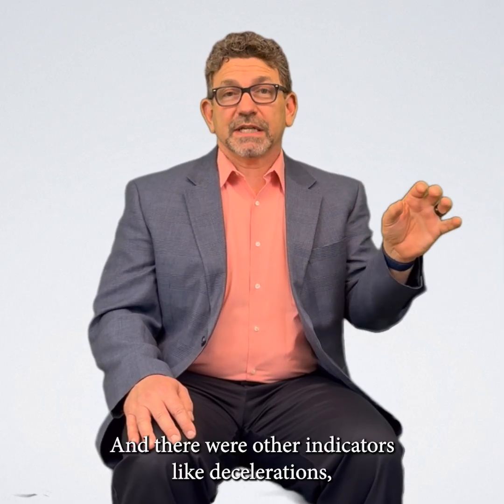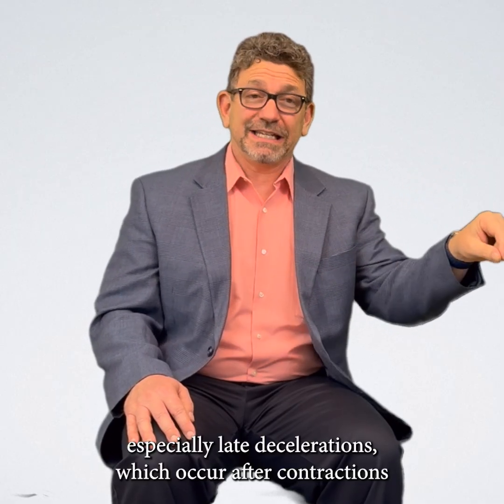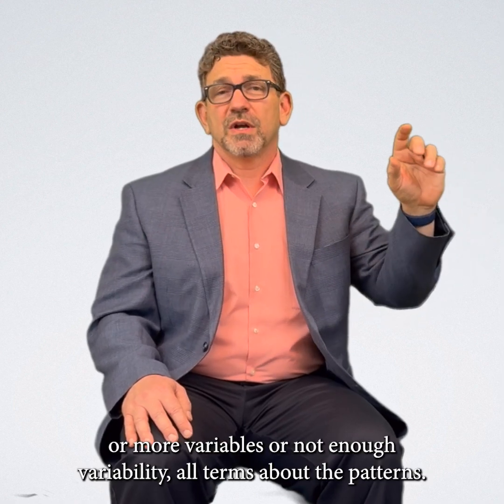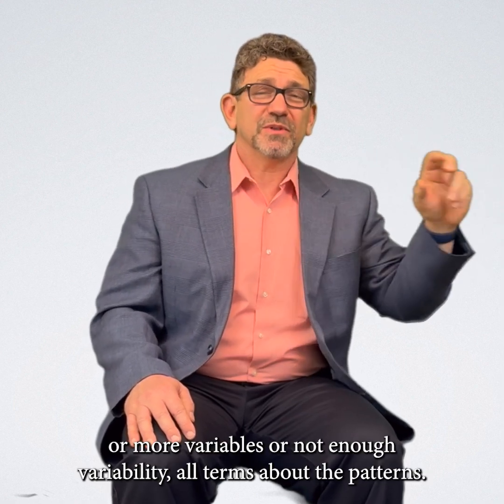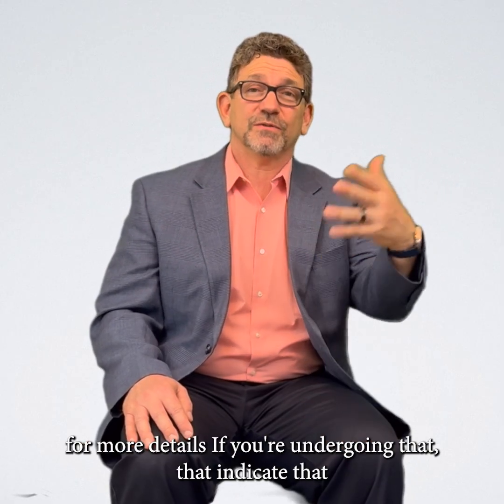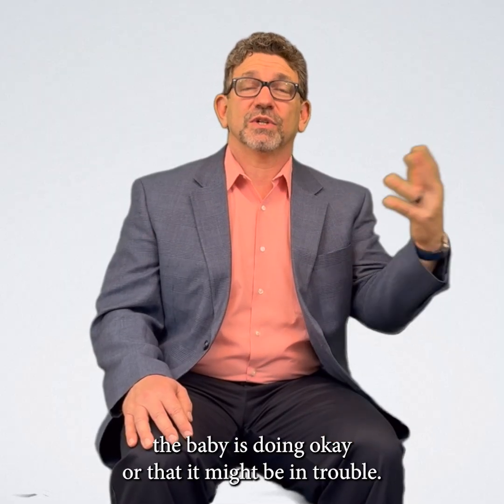And there were other indicators like decelerations, especially late decelerations, which occur after contractions, or more variables, or not enough variability. All terms about the patterns. You don't need to know those details, but you're welcome to ask your provider for more details if you're undergoing testing that indicates the baby is doing okay, or that it might be in trouble.